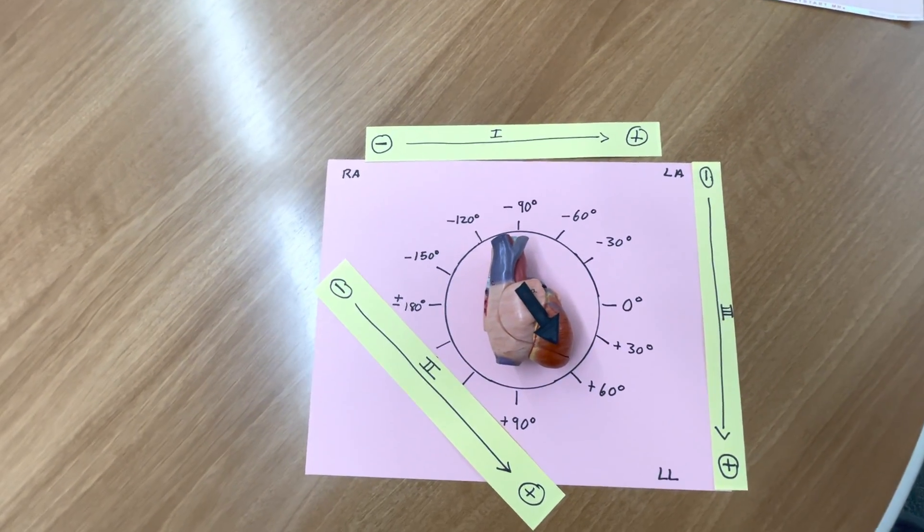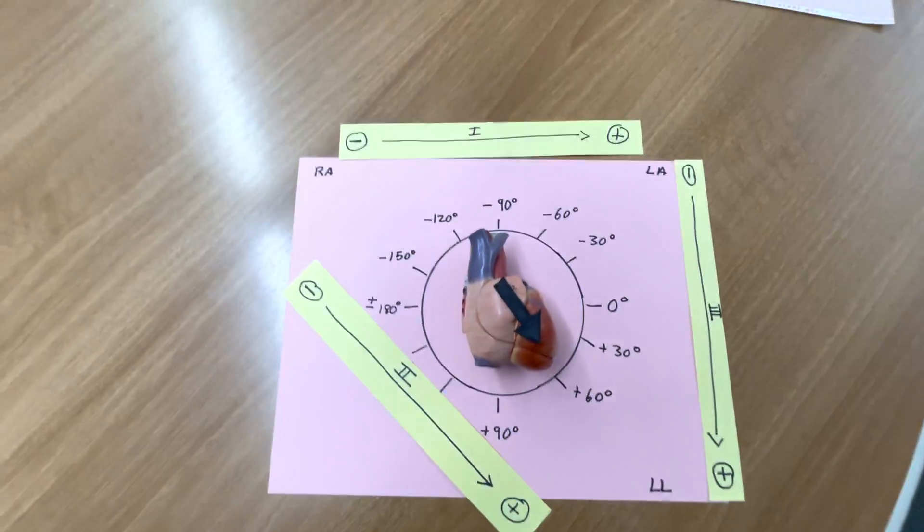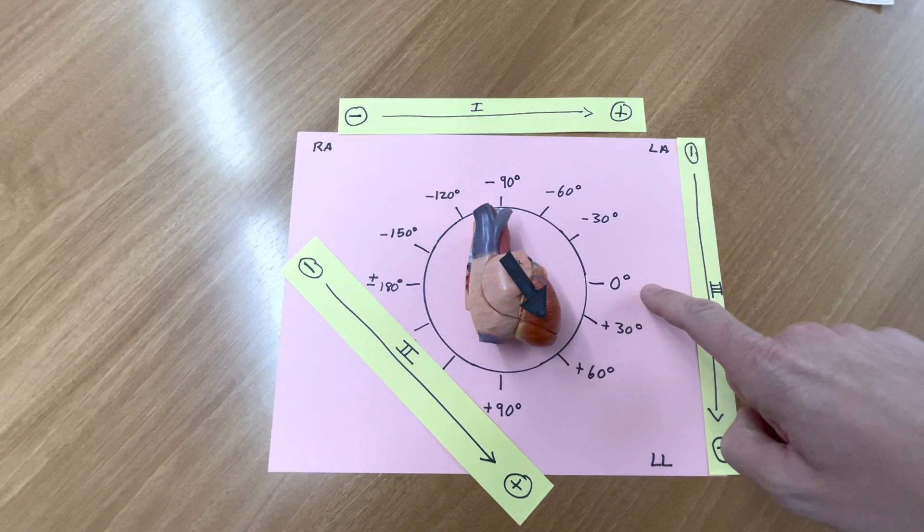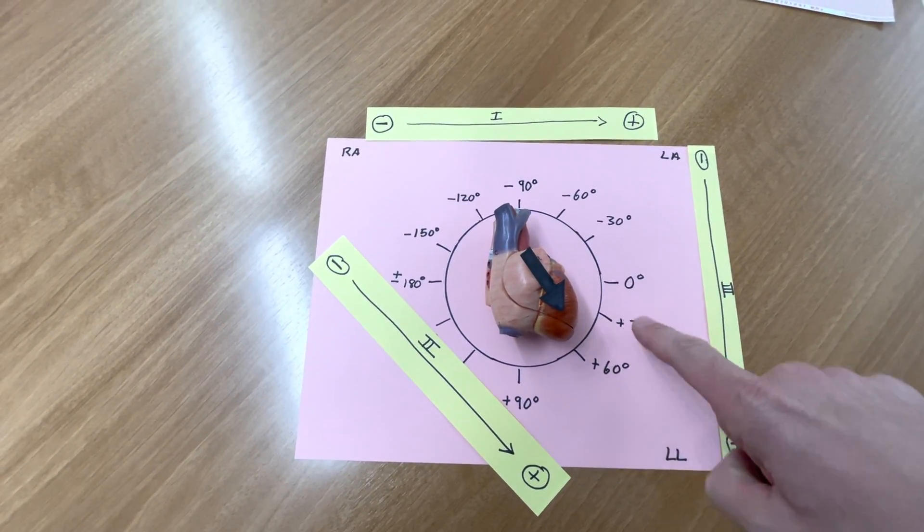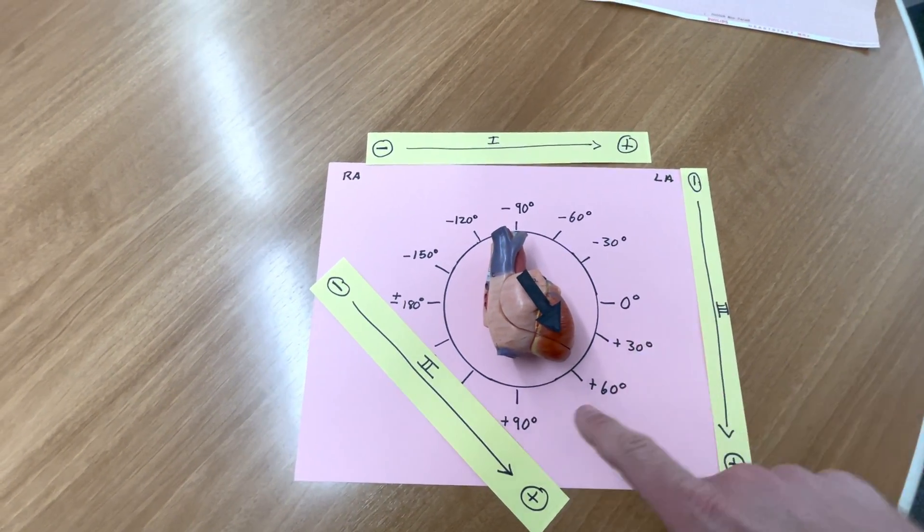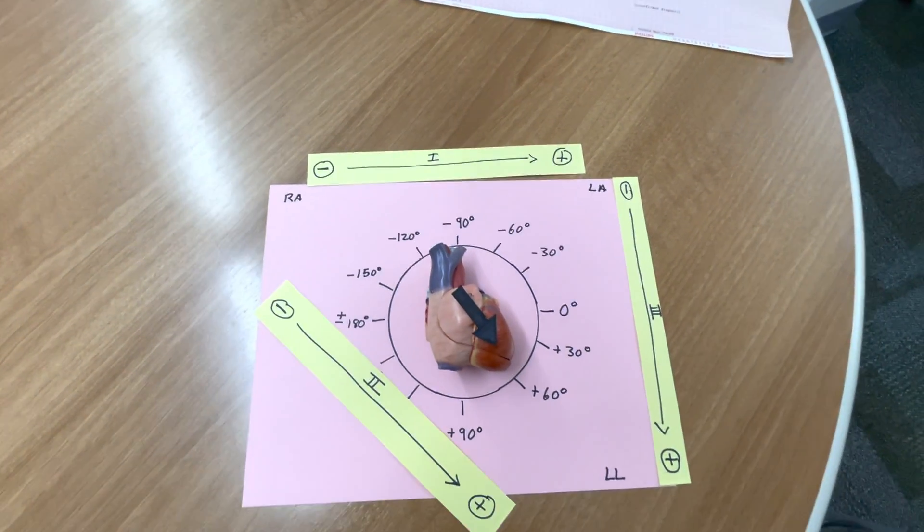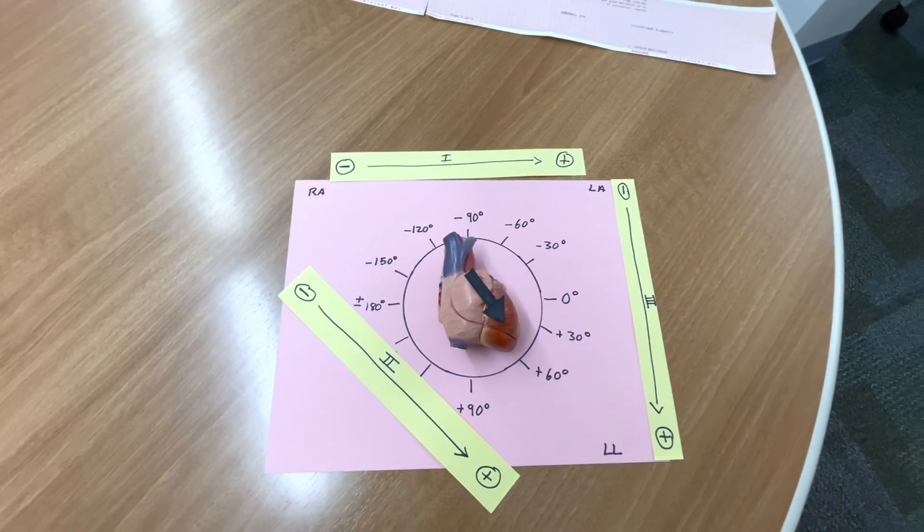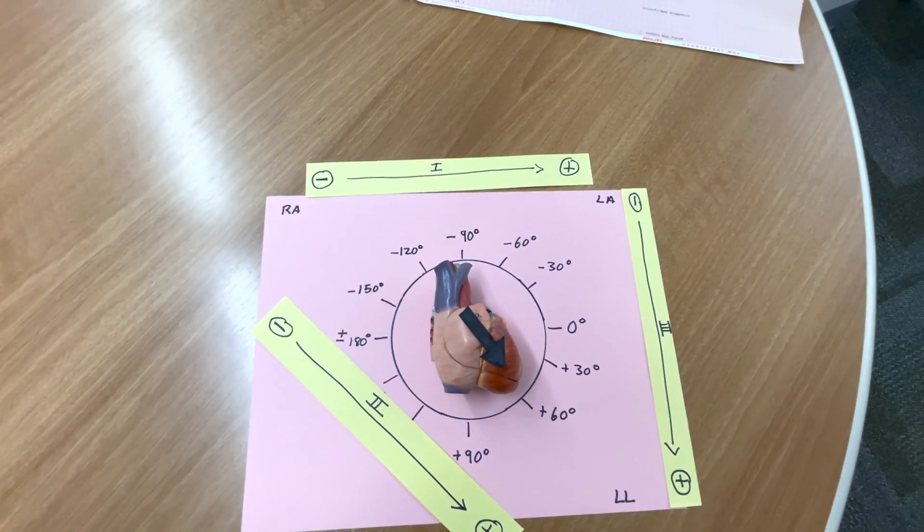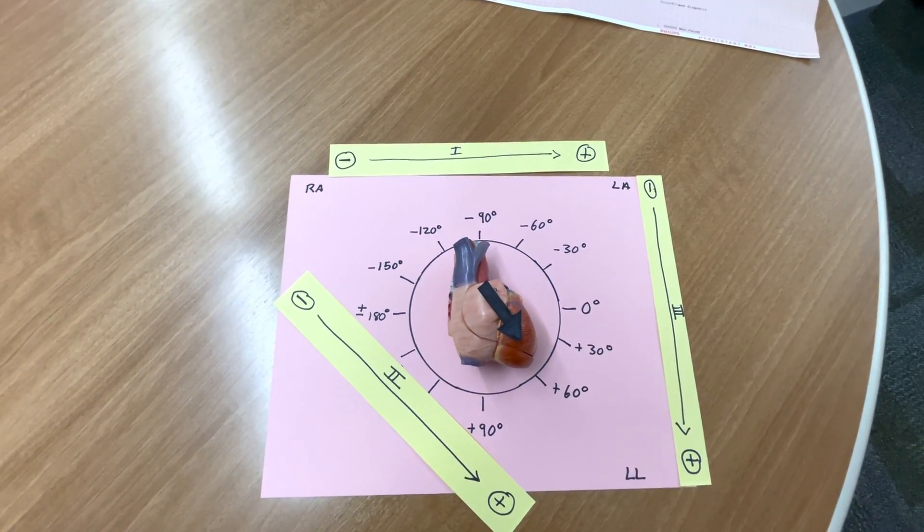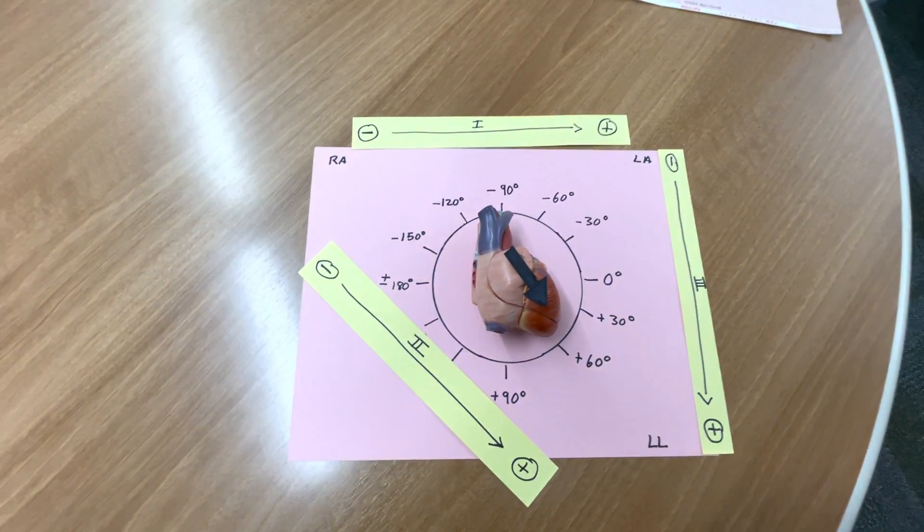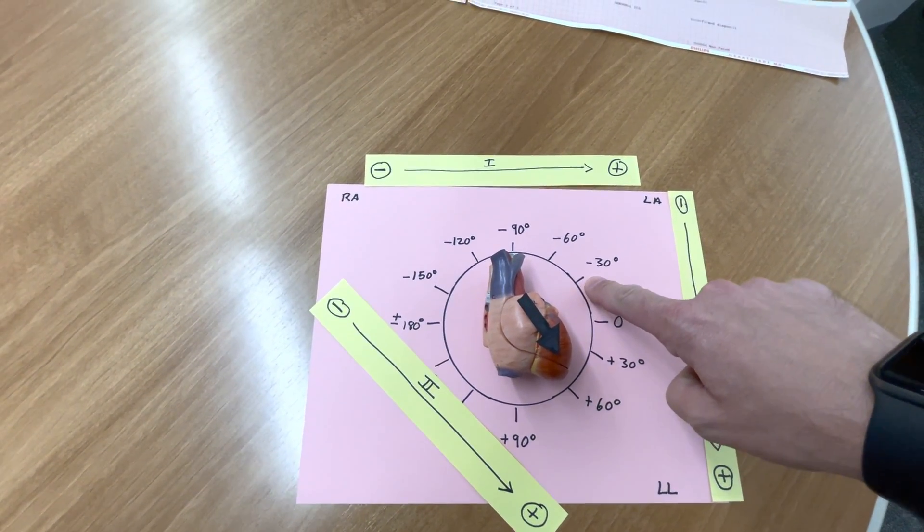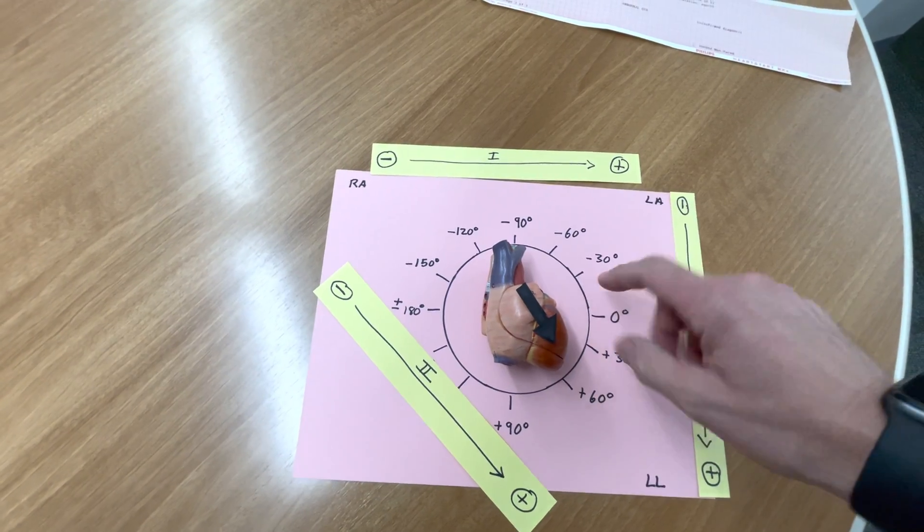Normal axis is generally considered 0 to plus 90 degrees. So, that arrow is going from 0 to plus 90 degrees. Anywhere in this range is considered normal. All three QRSs will be upright in the limb leads.